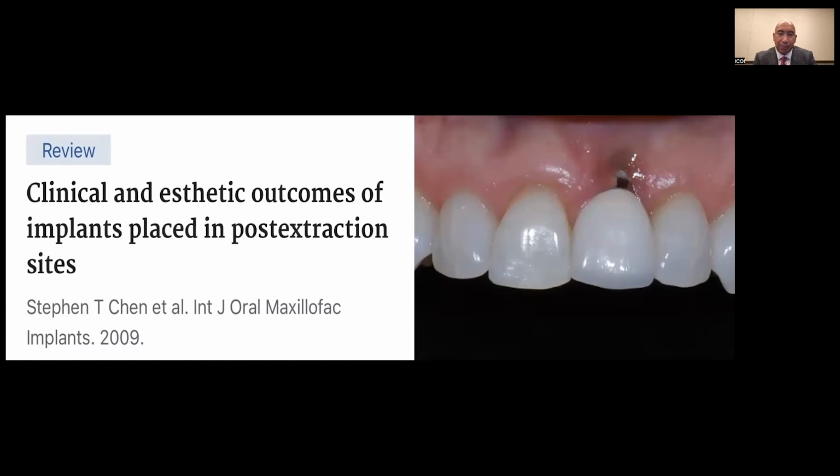So when we talk about supposedly the most ideal way for maximum implant aesthetics, the best treatment out there, like if you were to ask anybody, most people say, well, that would be an immediate implant. Take out a tooth, put an implant in, put a provisional on it. That's the best way to get the best aesthetic outcome. That preserves the hard and soft tissue.